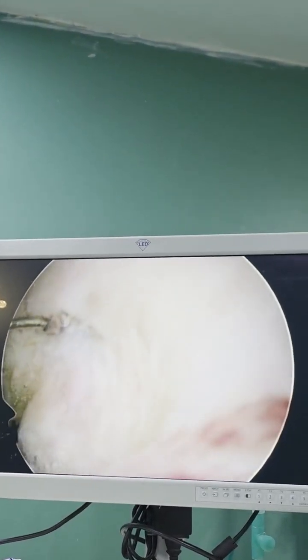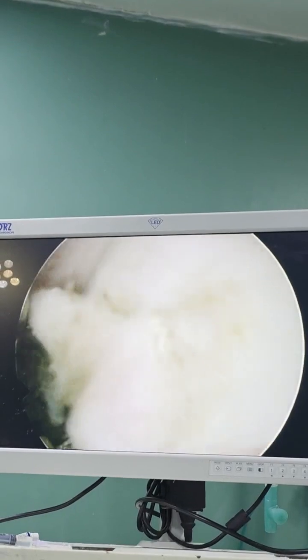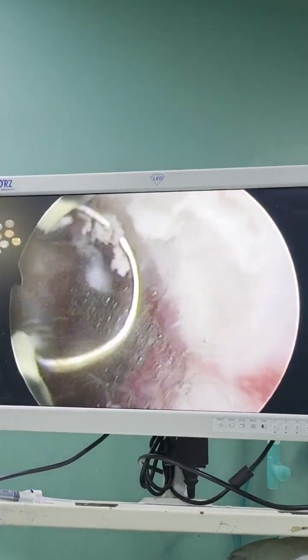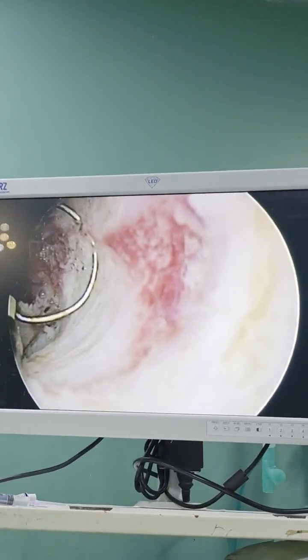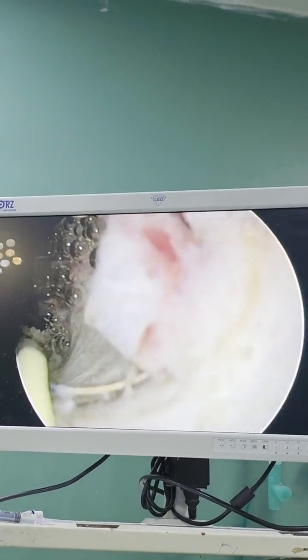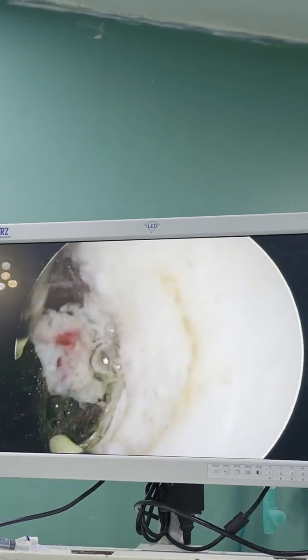And here, now you can beautifully see the base of the isthmocele, which is very inflamed, and we have to reduce the inflammation and take care of that. The scar thickness should be maintained so that in a future pregnancy it does not rupture during advanced pregnancy.